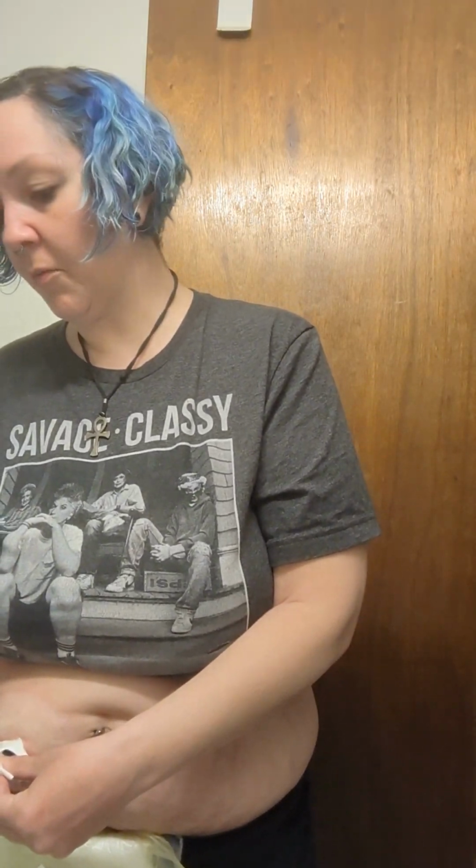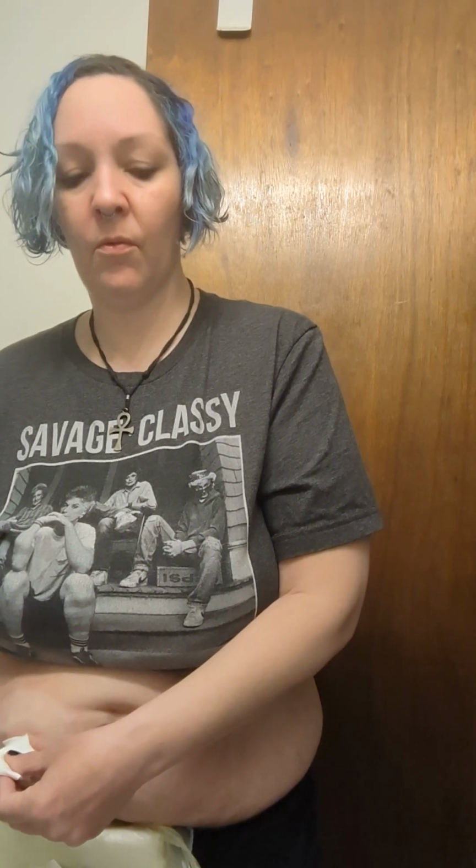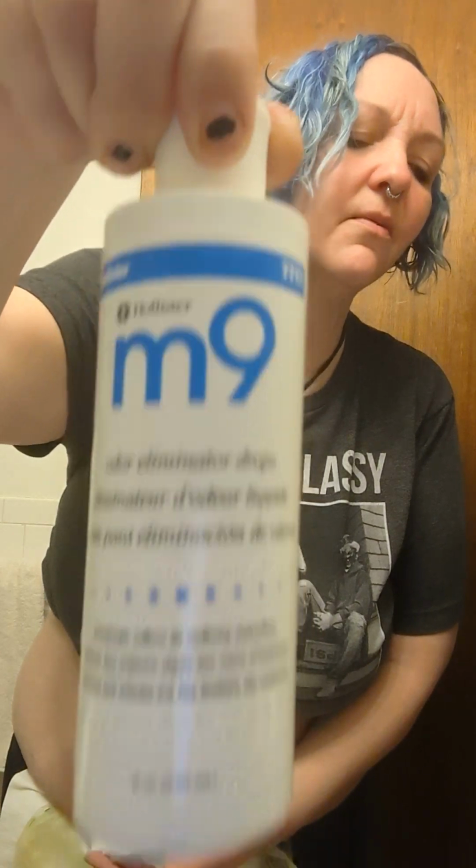Having a stoma, a lot of people have asked me awesome questions. I've been getting phenomenal questions, and I can't appreciate it more when people come to me and say, hey, what about this, what about that? So while my skin dries, which is a very important part of this, I wanted to go over a huge bonus about having a bag versus having your conventional bum. This stuff you put in your pouch, it literally doesn't stink. It doesn't even smell. If only they made something like this for conventional bum folks. But I got a bag, so now I don't have to smell my poo. And that's rather lovely, if I do say so myself.